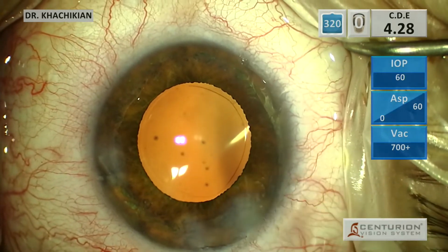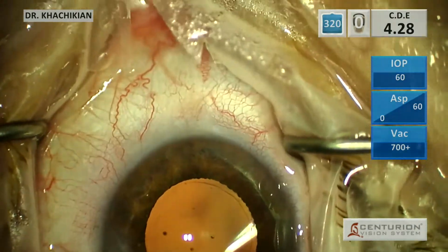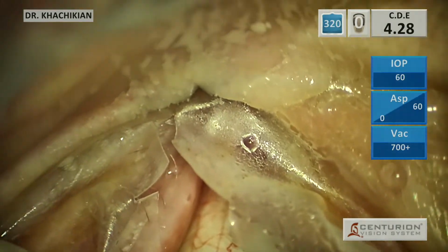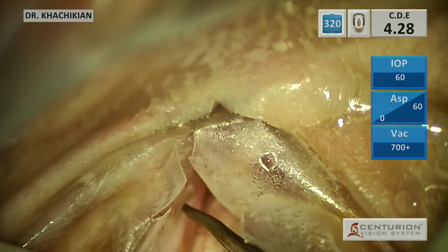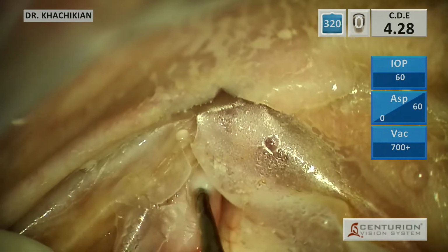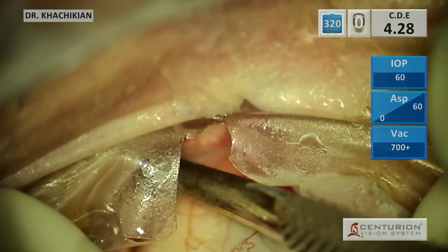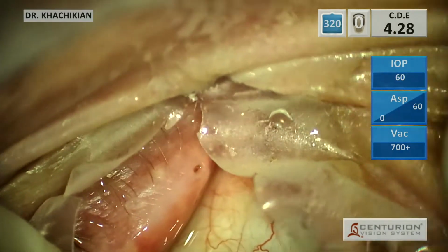Now in this case, what we are going to do is place a Dextenza in the punctum. I do kind of like the Dextenza. It seems to work pretty well and go in pretty easily. There's the punctum. I will dilate the punctum with the punctal dilator. I really do push pretty hard. The patients don't seem to feel it very much. I use the narrow end and then the wide end. The wide end looks very wide, but it tends to dilate the punctum very well as well.